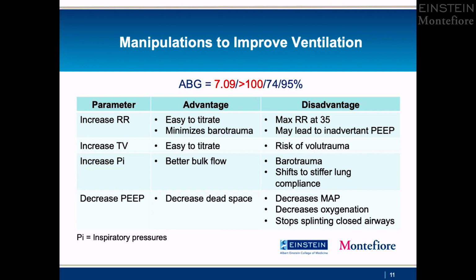In pressure preset modes, increasing inspiratory pressure will allow for higher tidal volumes. High inspiratory pressures can decrease lung compliance and also increase risk of barotrauma. Decreasing PEEP reduces dead space and improves ventilation. It can, however, decrease mean airway pressures and oxygenation as well.